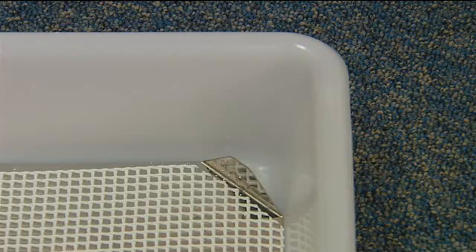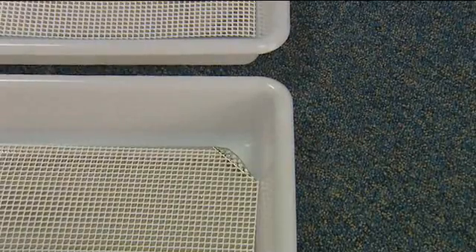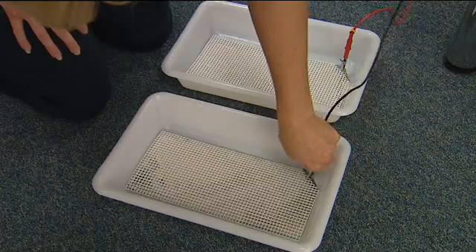The electrodes are placed into the foot baths, ensuring that the upturn corner is in the upper left quadrant, and the acrylic grills are placed on top of these. Plug the leads into the corresponding colour sockets on the left hand side of the machine and attach the crocodile clips to the electrodes.